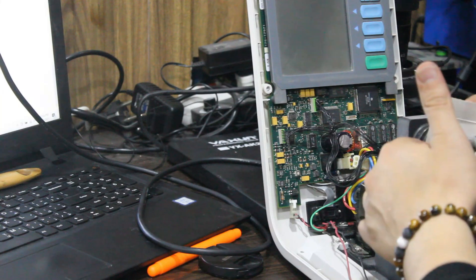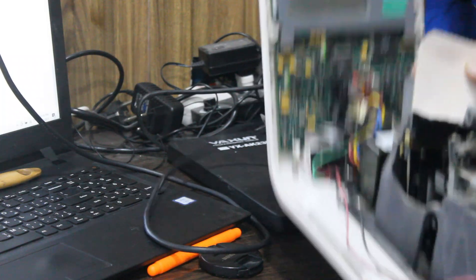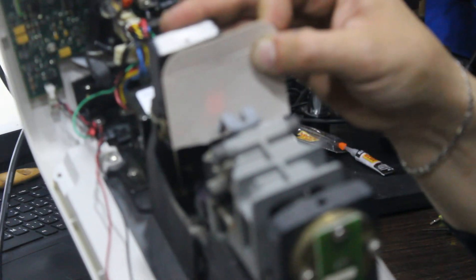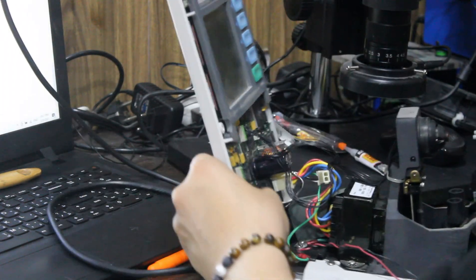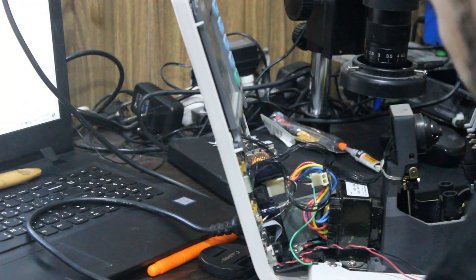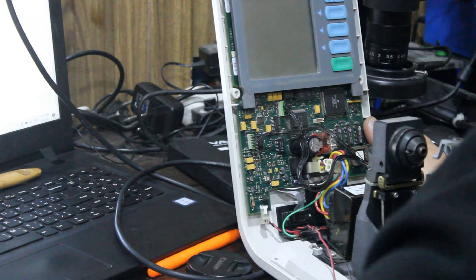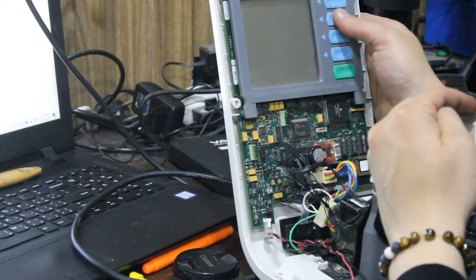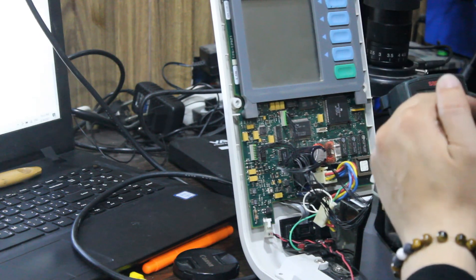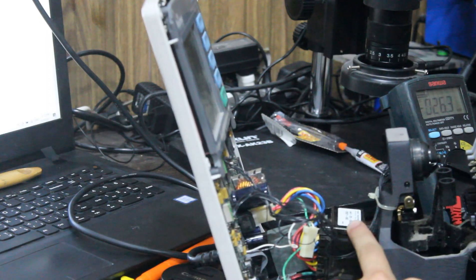There is a light but nothing on the screen. Now we need to check the power supply. As we can see here, 220V signal transformer — AC to AC.